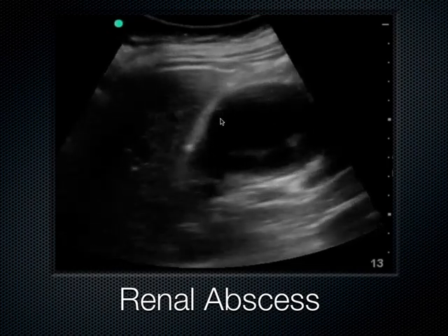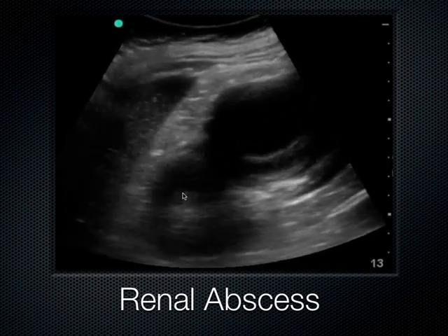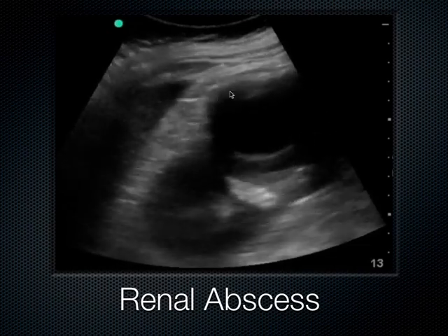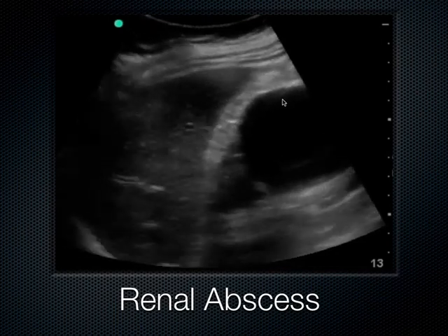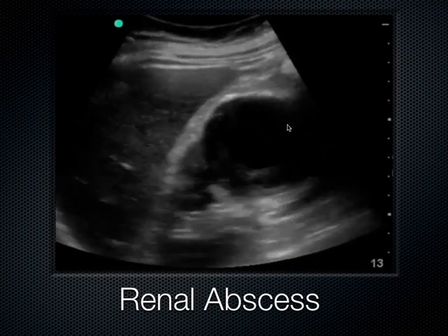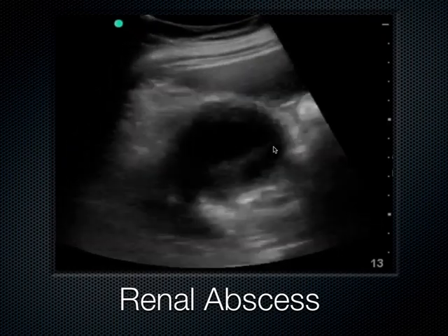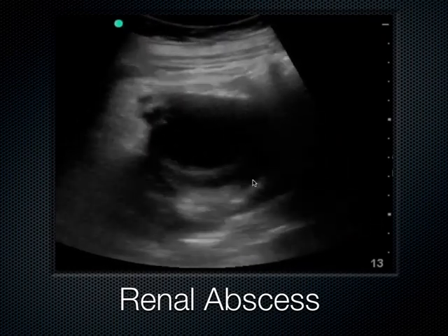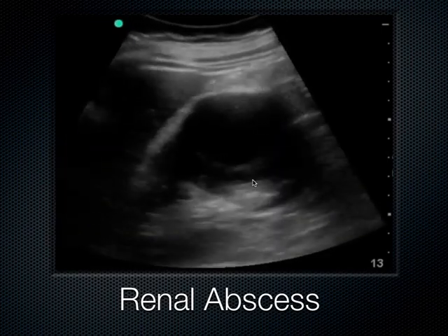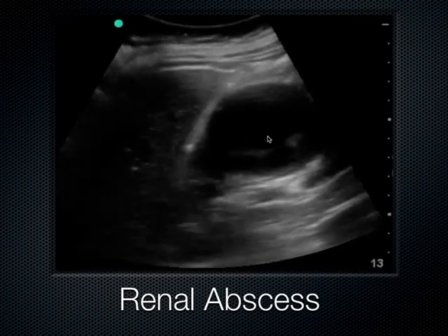You can also see an abscess in the kidney. This is a renal abscess. The normal renal parenchyma is seen down here, and when you get to the lower pole of the kidney, it's got this very large hypoechoic region. I agree it's a little difficult to see. I would turn up the gain on this patient. This is the liver seen here, so this must be the right kidney. They go into the short axis, and we can see this area here that looks very hypoechoic. It's within the lower renal pole, and this is what a renal abscess looks like on ultrasound.